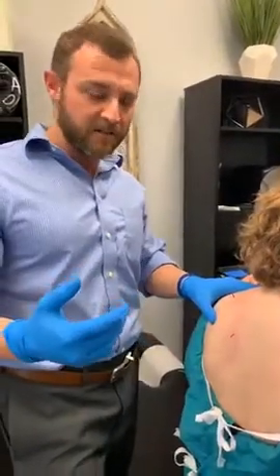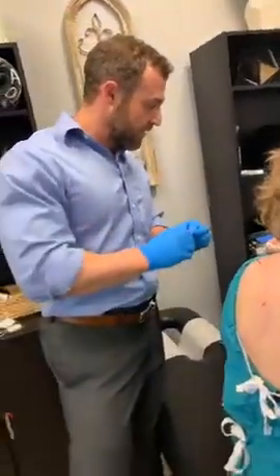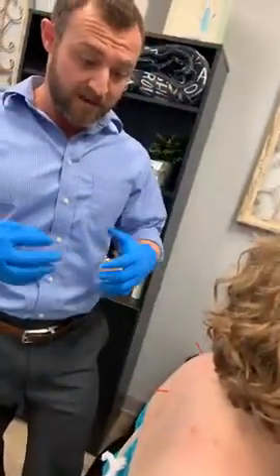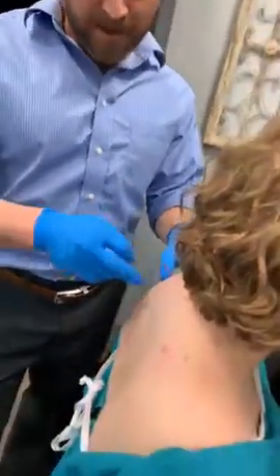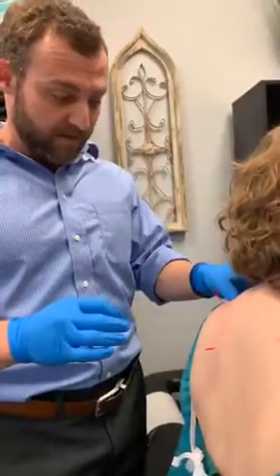Sometimes in your athletes, if you're working on the gastrocs or the calf muscle, or areas of the lower leg, any of those spots, sometimes you have to do that just to make these knots be affected. But in the upper traps, the mid-rhomboid area, it doesn't typically have that effect, so you don't have to do that as often. Sometimes just a needle in the knot itself is enough to dissipate it.